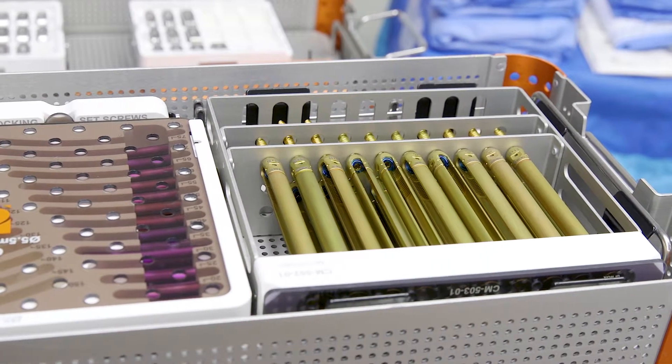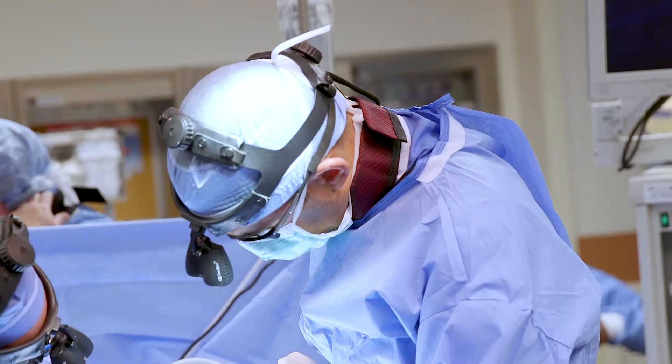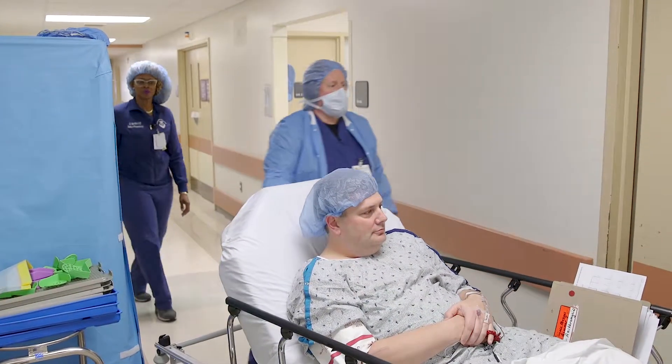Once this was configured, we really saw the benefits inside the lab, and now over the past year or more we've been utilizing this in our daily practices, and what we see is a truly superior direct midline anterior cage.